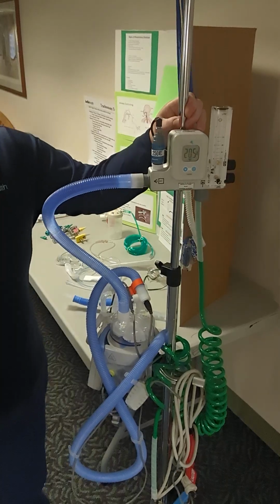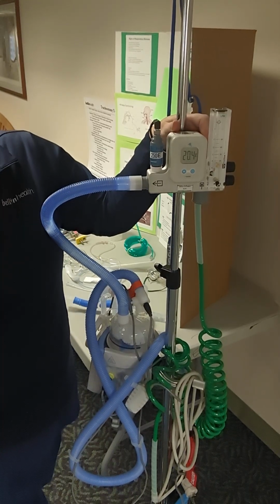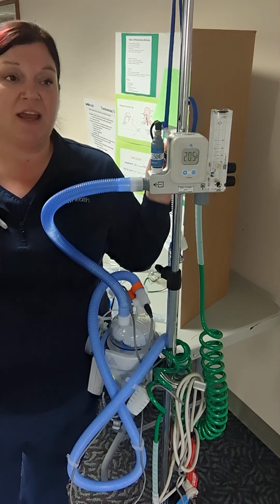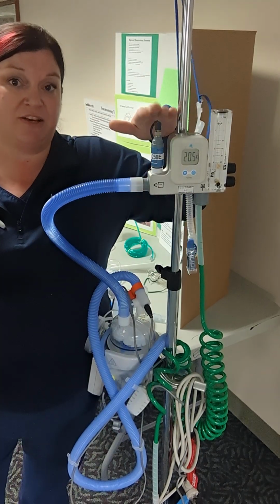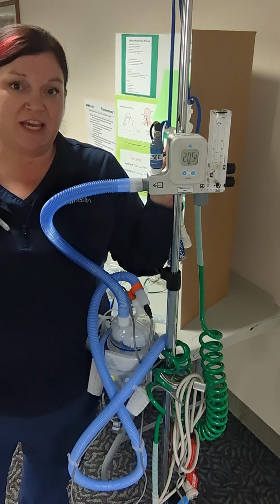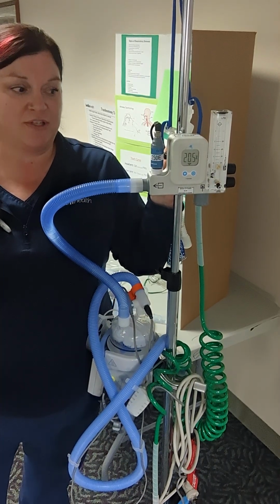Optimal humidity is a heated humidified nasal cannula that is at the perfect internal temperature for our patients to receive it, because oxygen that comes out of the wall, like we hook up to a flow meter, that oxygen is cold and dry. And if we were to attempt to deliver 20, 30, 40, 50, 60 liters of flow with cold, dry gas, we would actually cause damage to those patients' airways. So we are not going to do that. We are going to heat it, we are going to humidify, and then we're going to provide that to our patients in the hopes that increasing that flow is going to help with shortness of breath.